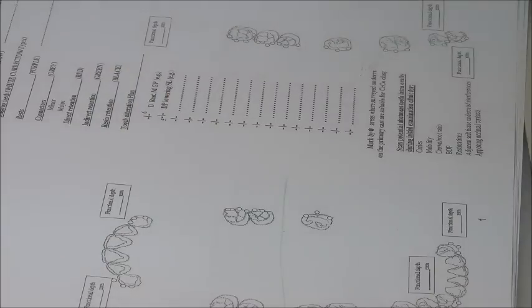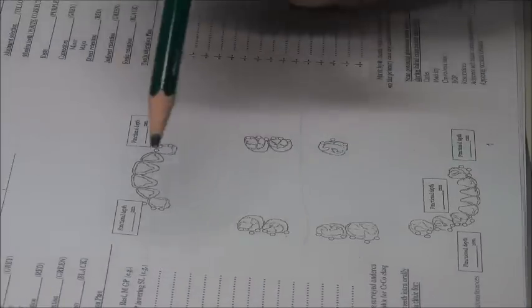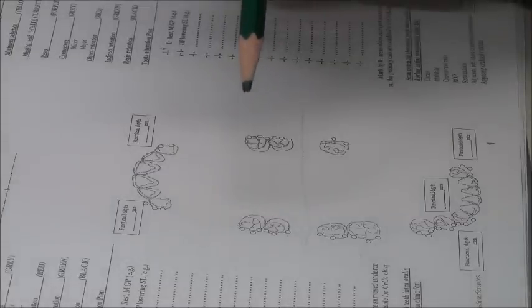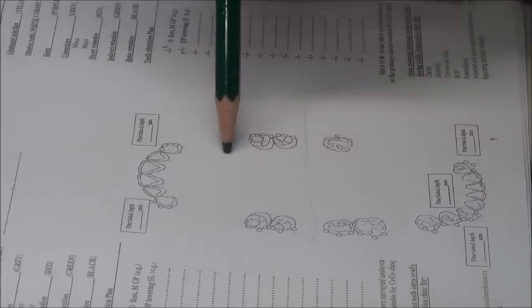Now let's move to our case. First case on the left. Now the cases one by one will become more difficult, meaning that I have to think of more than one thing at the same time. Okay? So let's take this. Okay, this is bounded. Let's go back to the basic design. What is the basic design? Basic design. Bounded. What classification is this?